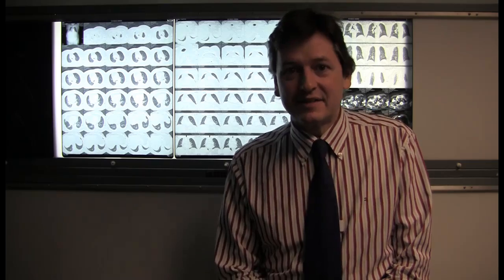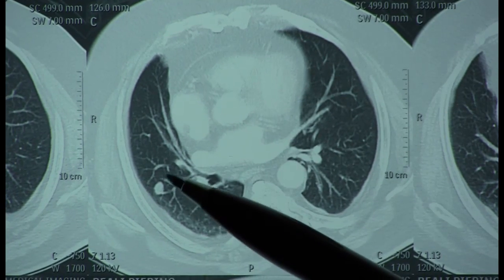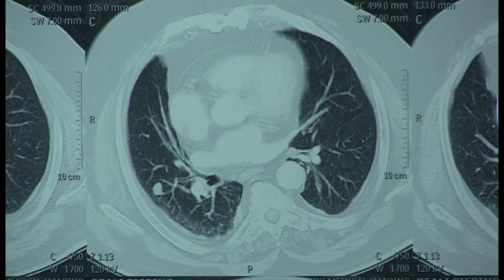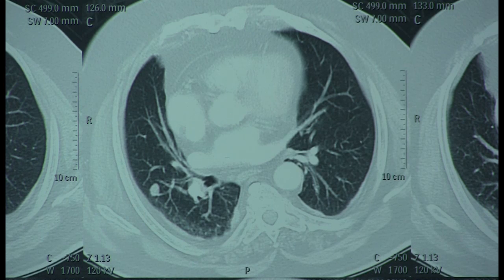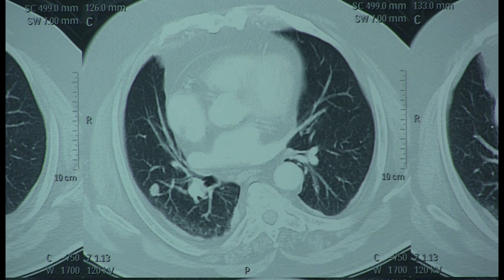For this technique you need to have a working parietal lobe, which I'm sure the consultant radiologists and trainees watching this video will all have. This is the target lesion — a little colorectal metastasis in this gentleman's right lung. He's been staged with PET and other CTs; this is his only manifestation of metastatic disease, so our procedure today is being conducted with curative intent.